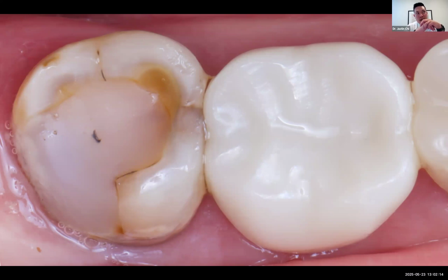There are some really challenging situations where I think, gosh, even this is kind of limited surface area. I'll take a coarse diamond before I sandblast and just roughen, score the surface. And those channels, at least in my mind, this should probably be studied, and I've made that suggestion to our R&D department, so hopefully we get to look at it at some point. But I roughen the surface with the bur. Of course, there's downsides of doing that too aggressively, but I roughen it, see these visible channels, and then I'll air abrade over that. So that's kind of an additional step in my mind, and I've had pretty good success there. Knock on wood, no failures, no debonds in those situations.